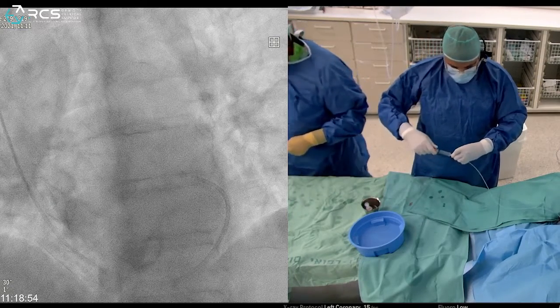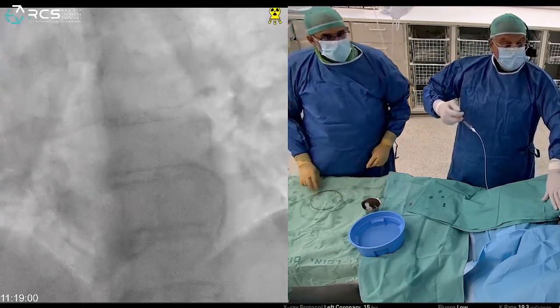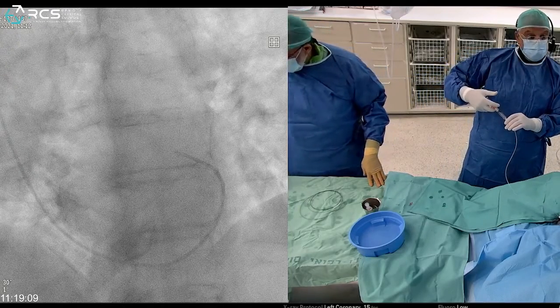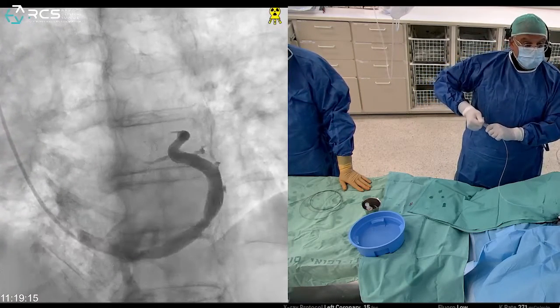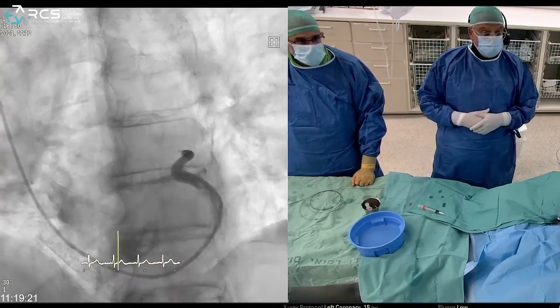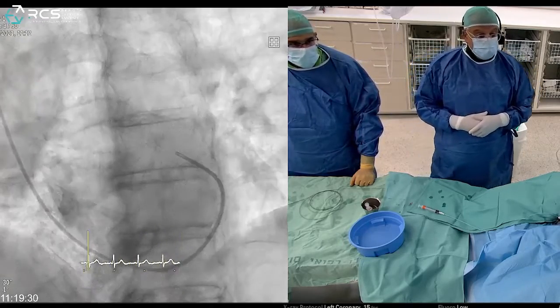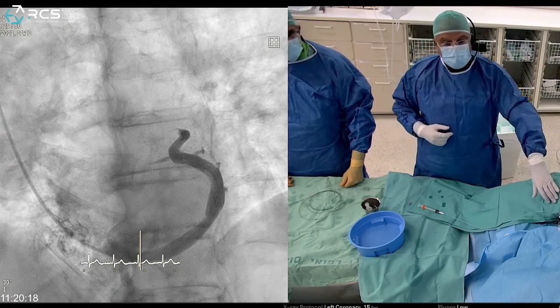Before I inject I always take a small test to confirm I'm not in a small branch — the tip of the catheter is not in a small branch, so I won't inject forcefully and risk breaking it. Taking a full angio: very nice. We see a nice-looking coronary sinus. At 12 o'clock is the great cardiac vein; down below at 6 o'clock near the ostium of the coronary sinus are two branches draining the right coronary artery.